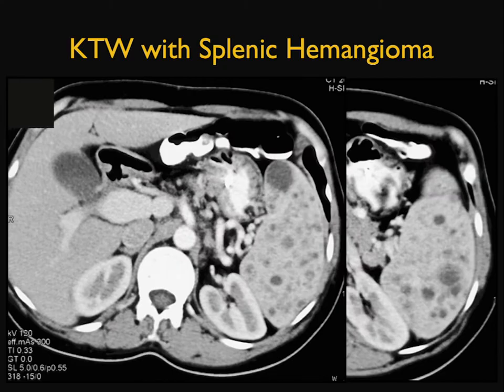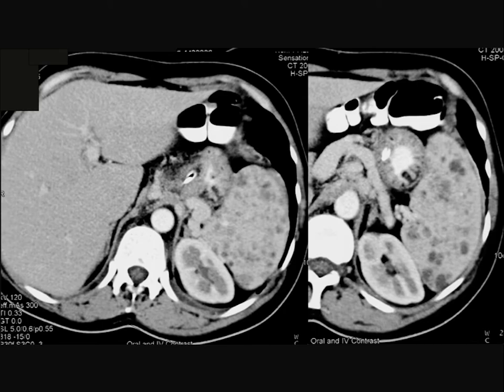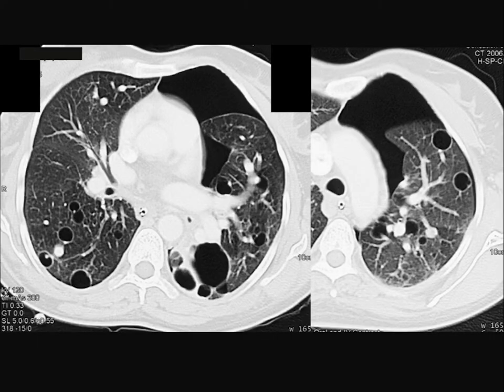I mentioned Klippel-Trenaunay-Weber. Look at these multiple splenic hemangiomas. If I told you the patient was febrile, you could think about abscess. If I told you the patient had weight loss and fever, you could think about malignancy. So these are indeed all going to be possibilities. Patients with Klippel-Trenaunay-Weber also get cysts in the lung and spontaneous pneumothoraces.